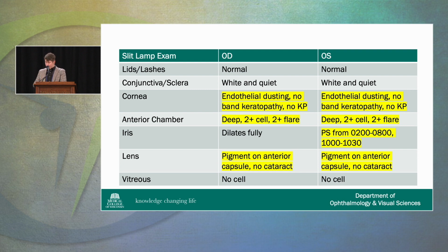I do want to point out that this is a slit lamp exam and this is a 3-year-old child. You can absolutely do a slit lamp exam on a 3-year-old child. They do not only need to go for EUA. If you start training them when they're younger, I have many patients that are 2 in my clinic that sit for their slit lamp exams. They do wonderful. You just have to start training them, and you see them monthly till they get the hang of it. You will get a better exam every single time in the clinic than you will with an EUA.